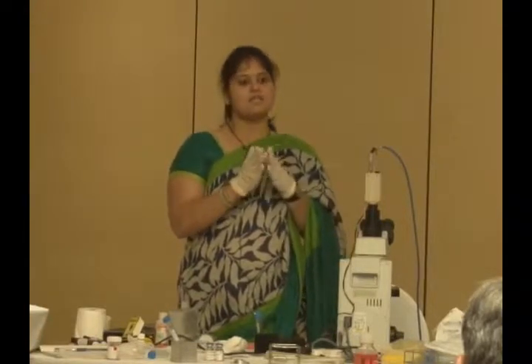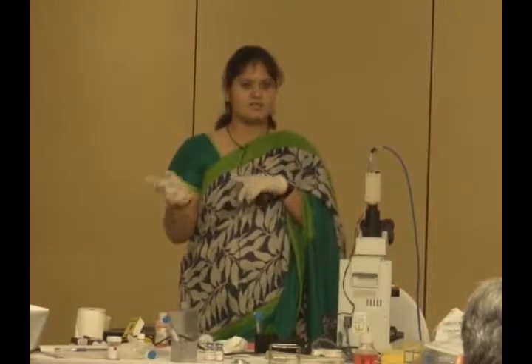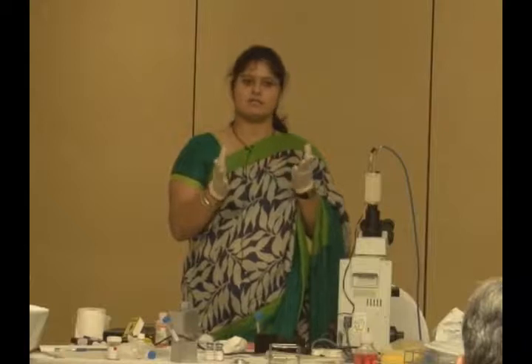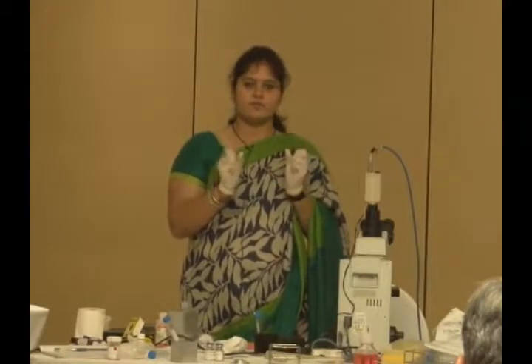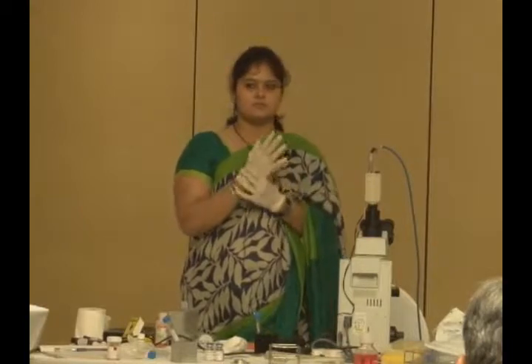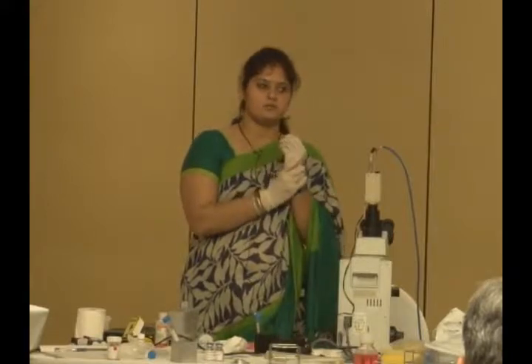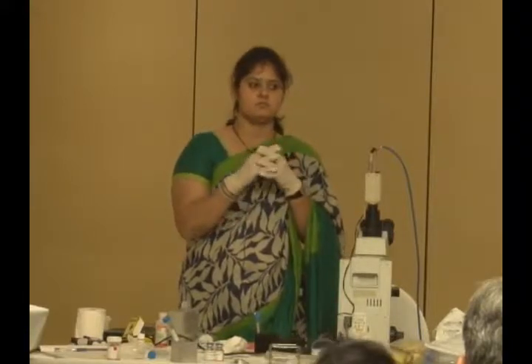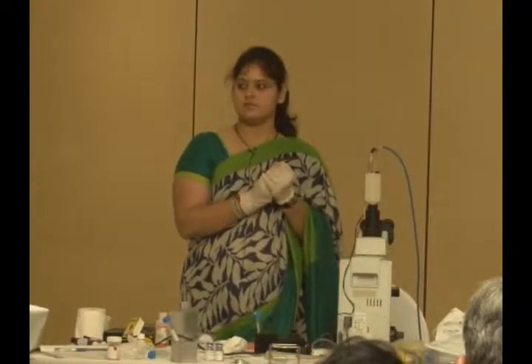Once the medium is in the incubator, it will not go back to the refrigerator because the protein denatures when the temperature changes. So be careful with this. Incubation is important. Any queries regarding the procedure?